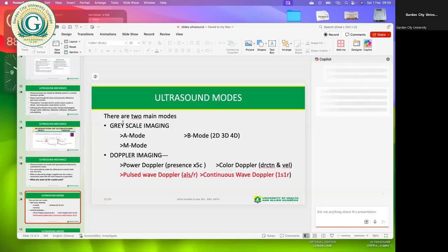So when you take an ultrasound image, or if you've seen an ultrasound image, you may have certain regions on that image appearing very black, whereas others will appear very white, and then some other areas would appear ash or in a form of gray, where some will be darker than the others. So that is the principle behind the B mode. I am hoping you are following.